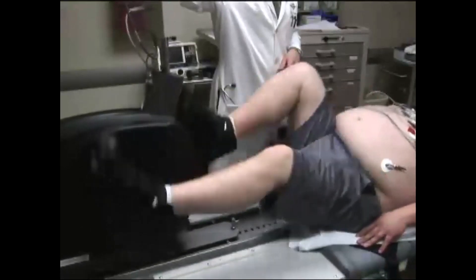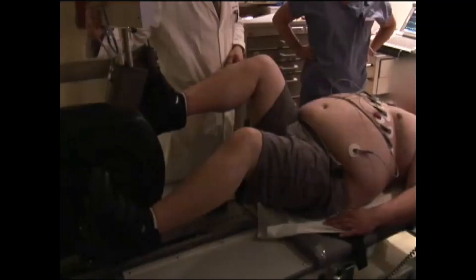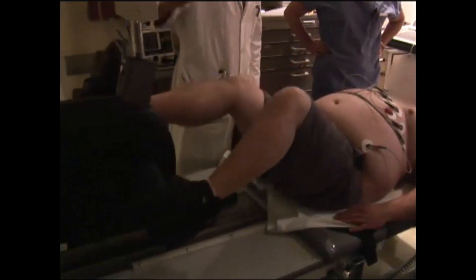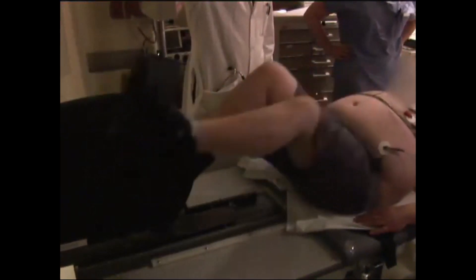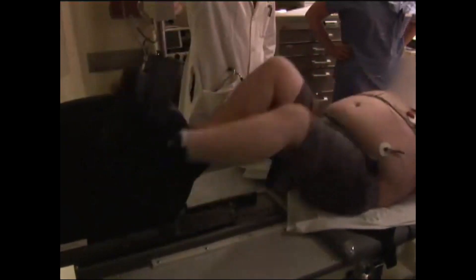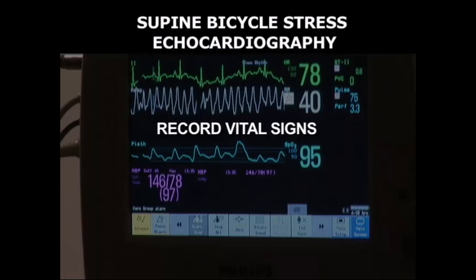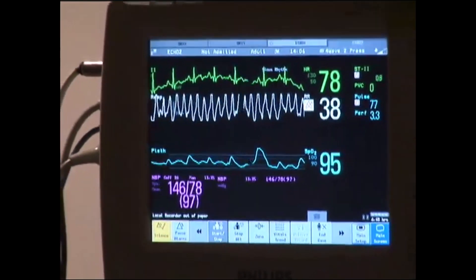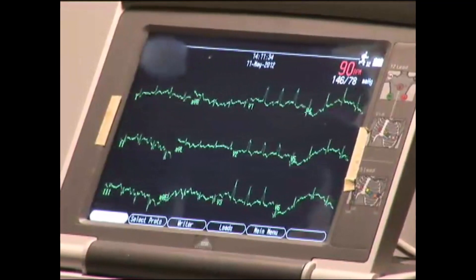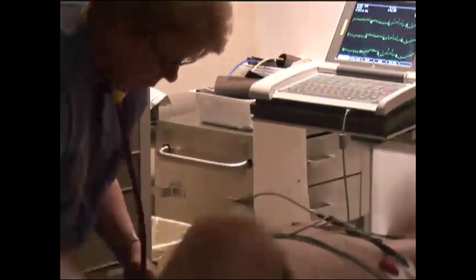Reposition the pedal length as needed. Once the patient understands the stress protocol and is comfortable with pedaling, the patient begins pedaling. Once pedaling at the appropriate speed, begin the stress testing protocol. The patient's vital signs are monitored throughout the test. Record a blood pressure and heart rate during each stage of exercise, generally during the last minute of each stage.